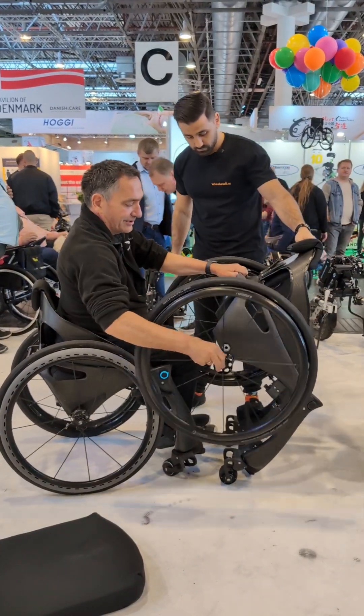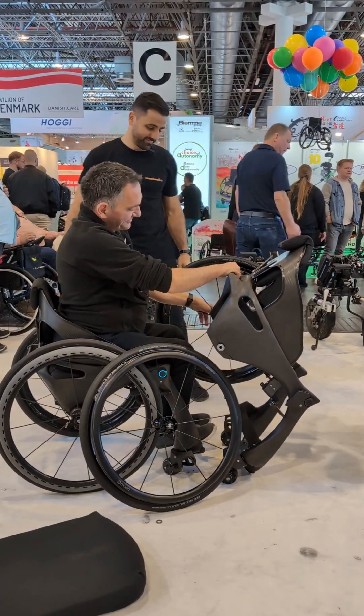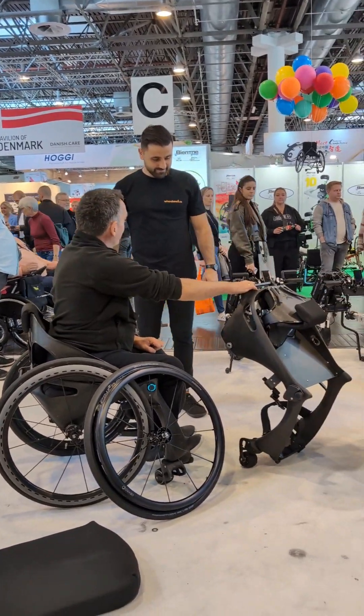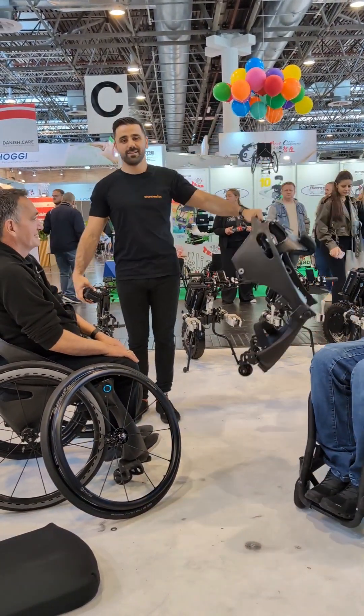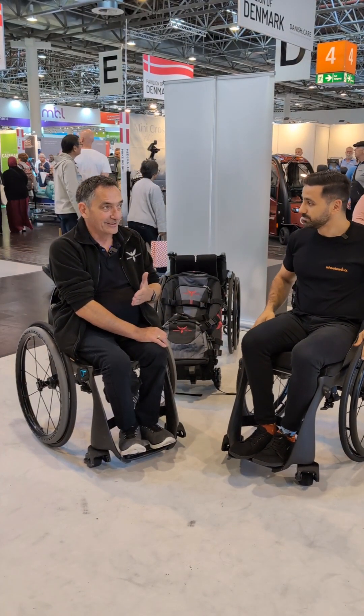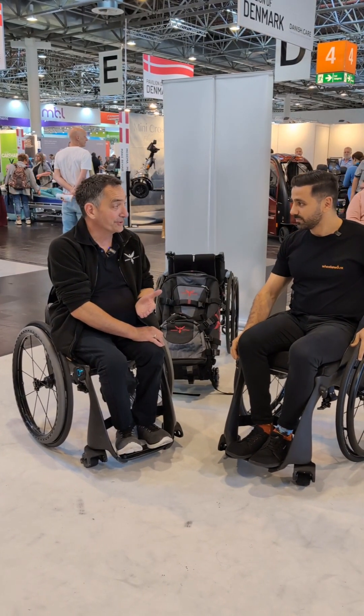This is a six and a half kilogram transfer weight with the power assist. Lift the battery out and you've got six and a half kilograms. Even with the power assist in it, you can pick it up quite easily and throw it into the car. So this chair's transfer weight is lighter than a lot of the power assist devices on their own.